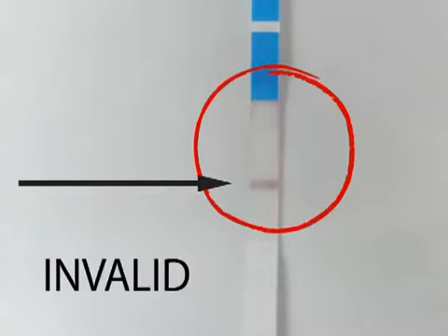For an invalid result, control line fails to appear. This could be as a result of insufficient specimen volume or incorrect procedural techniques. In such a situation, review the procedure and repeat the test with a new test strip. If the problem persists, discontinue using the test kit immediately and contact your local distributor.